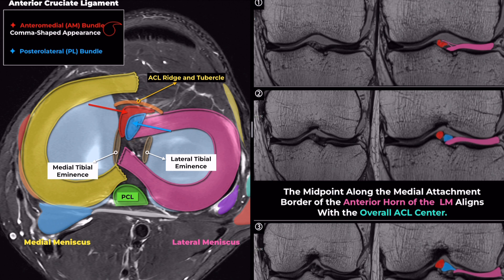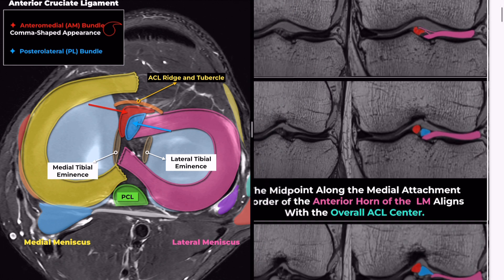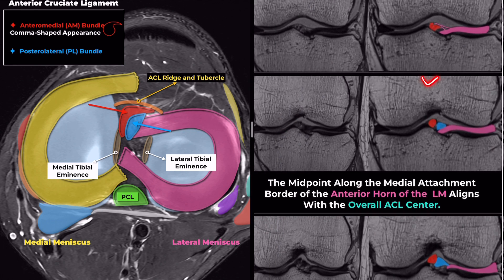In the anterior coronal image, the anterior horn of the lateral meniscus and the anteromedial bundle are visible. There is a fibrous connection between the anteromedial bundle and the anterior horn of the lateral meniscus. A slightly posterior coronal image shows the posterior aspect of the anterior horn aligning with the center of the posterolateral bundle.